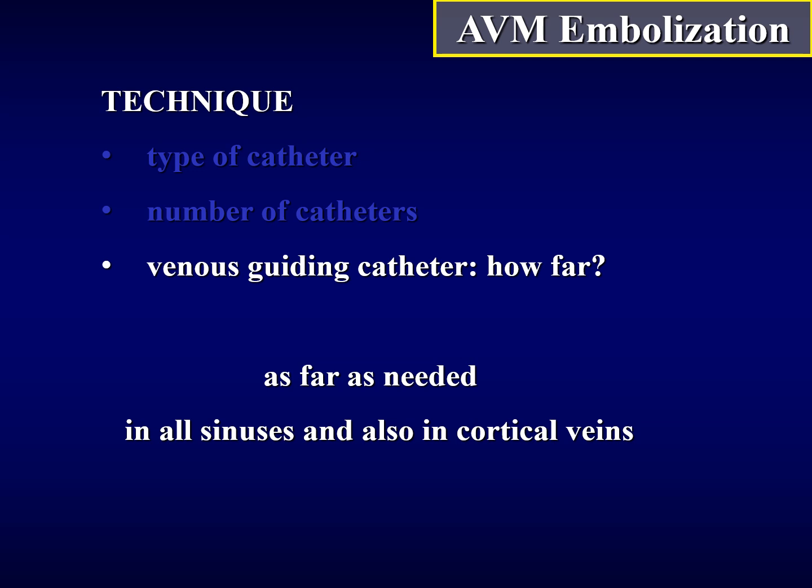Should we use a guiding catheter? Yes. All the times you need to go through a venous access. But how far should you go? Well, as far as needed. You may go in all sinuses and also in cortical veins.